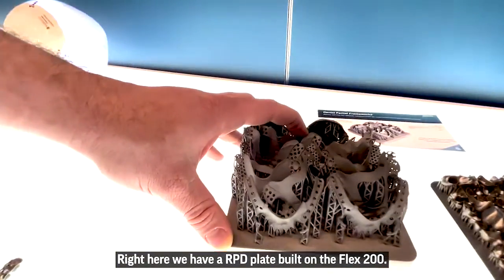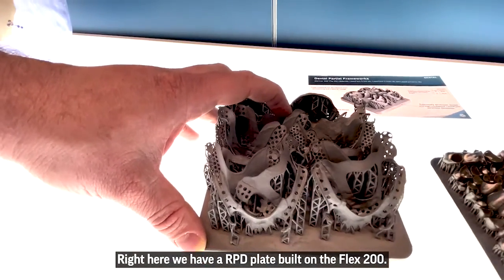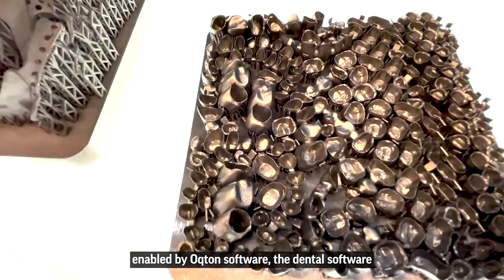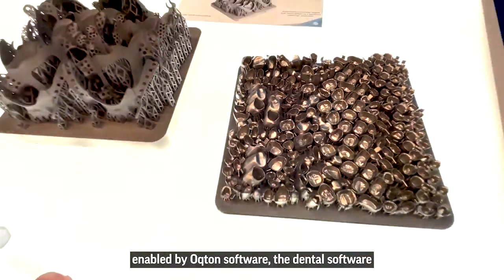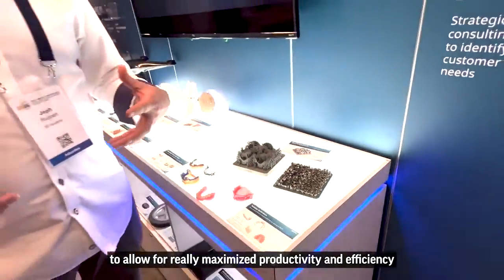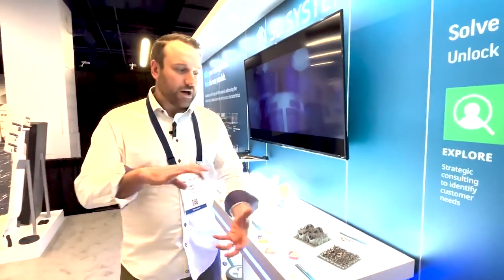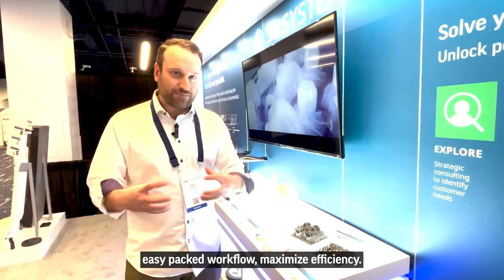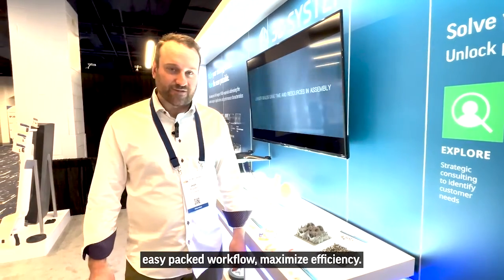Right here we have an RPD plate built on the Flex 200 — this is built on our small frame system — along with crowns enabled by Octon software, the dental software. It's allowed for really maximized productivity and efficiency, with algorithms to create a really streamlined, easy packed workflow for maximum efficiency.